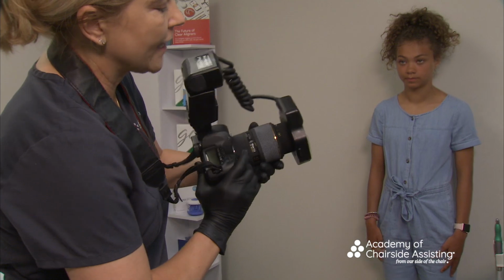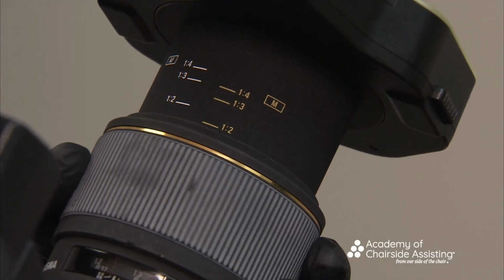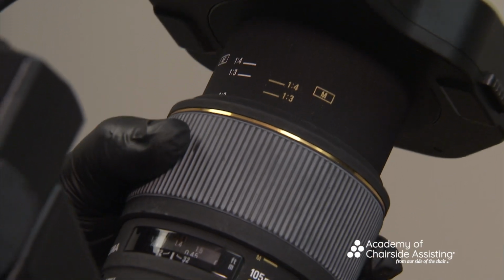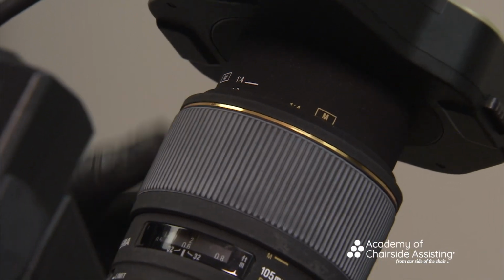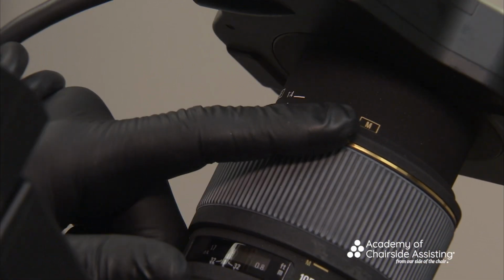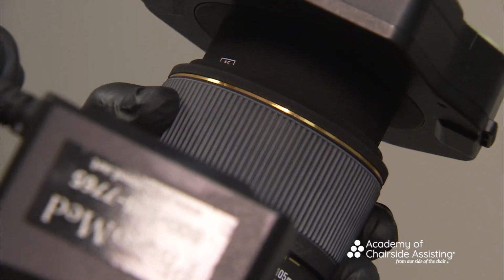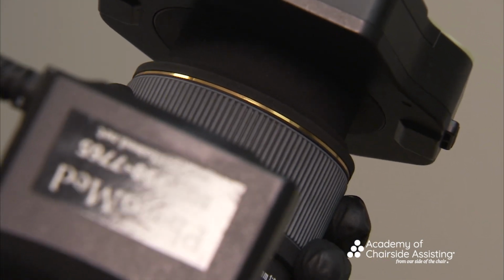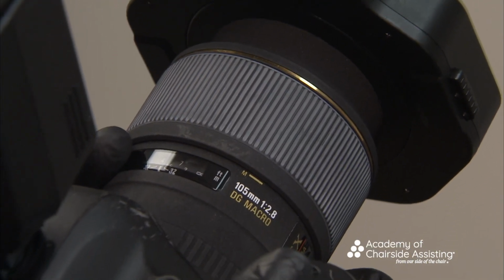So remember that we talked about why it's important to really look at these dials, okay? As we take our full face photos, we're going to roll the dial down because we were on manual, and we have automatic. I'm going to roll it just a little bit past that line. That's usually my guide, okay? Because we're going to have to get closer to Kylie.